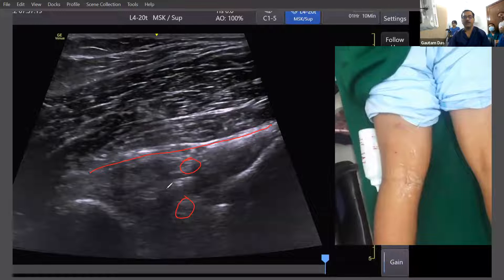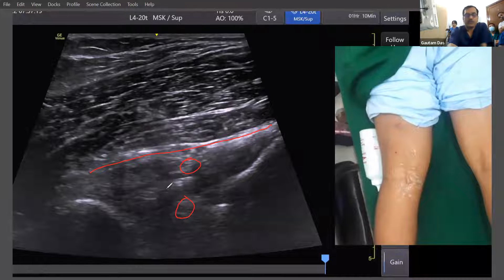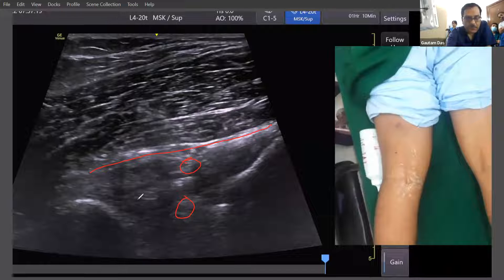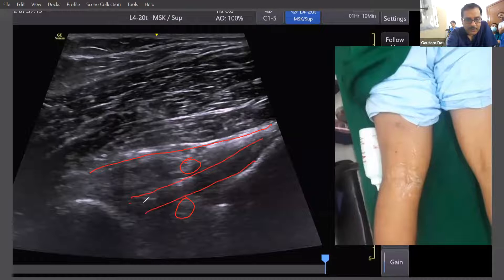The meniscofemoral ligament divides into two parts: the anterior part is called the Humphrey's portion and the posterior part is the Riesberg's portion. In between is your posterior cruciate ligament.